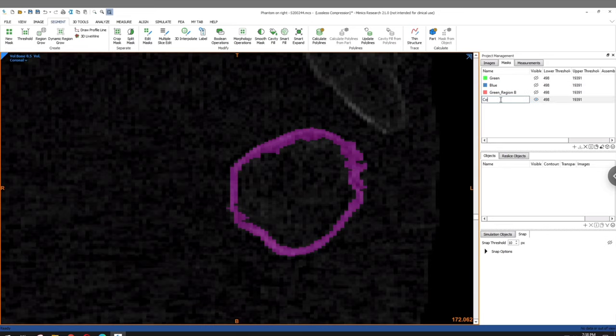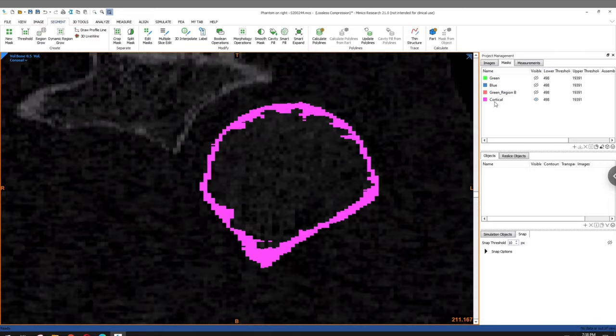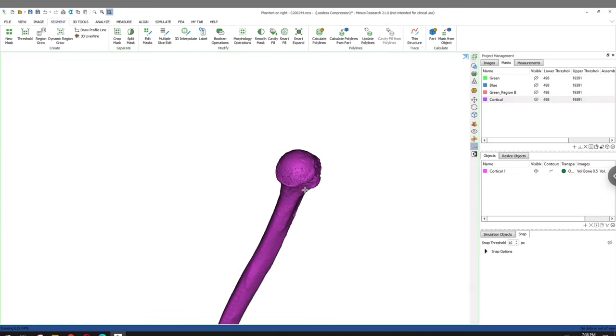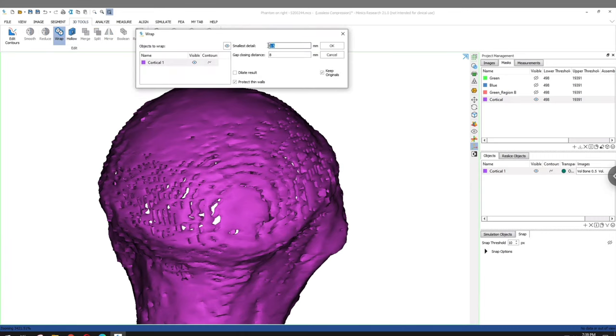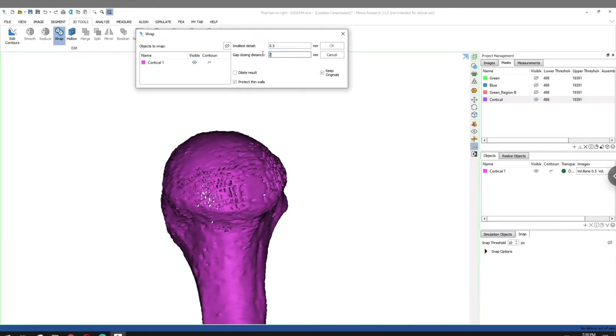As that process generated a new mask, I'm just renaming the masks so I can keep track of what I'm working with. Now, as we continue along here, I'm going to generate a 3D model of what we've completed so far, and as you can see, there are still numerous voids and gaps within this model. If you were purely making a solid body, you likely would be able to finish up here. However, in the context of creating a cortical shell and a trabecular mass inside of said shell, we need to make sure that our original masks are complete, as opposed to just jumping straight to the next step.